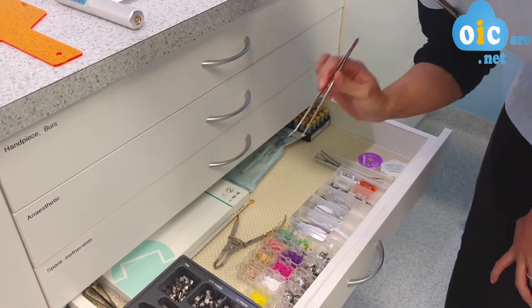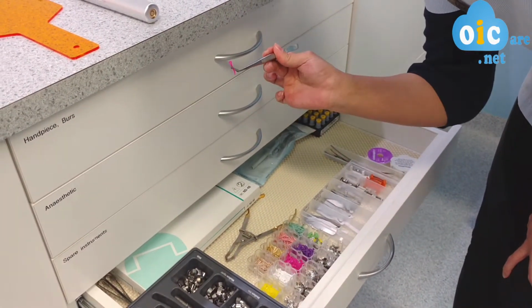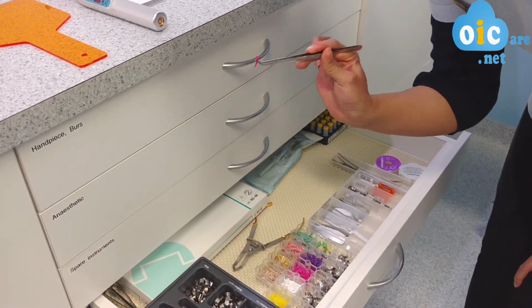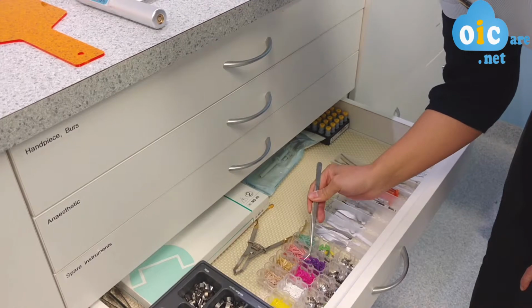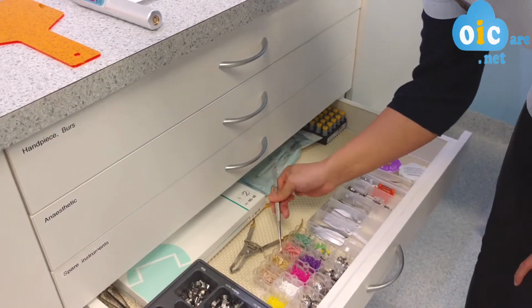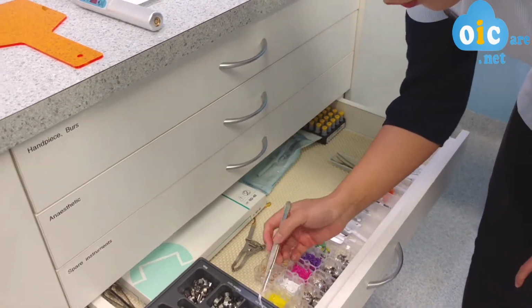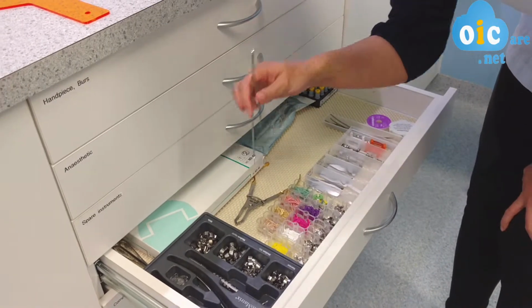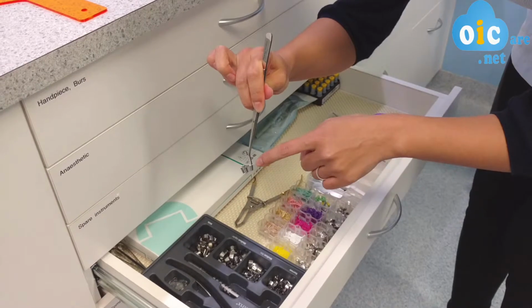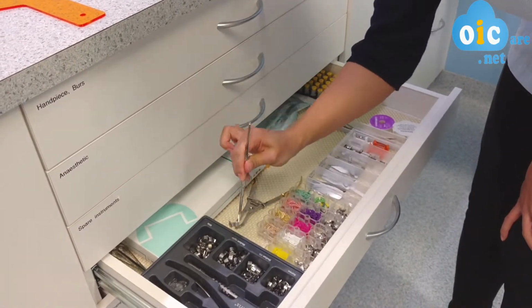After we put the matrix band down, we will put something called a wedge in between the teeth, which also helps to shape the filling so that we don't get any overhangs, and also keeps the band in place. They also come in different shapes and sizes, and different materials, wooden ones and plastic ones. If the cavity involves more than two surfaces, then we will use bands like this. If it involves both the front and the back of the tooth, then we will use something like this. This is called an auto matrix.